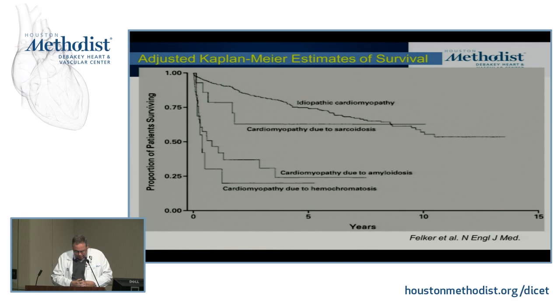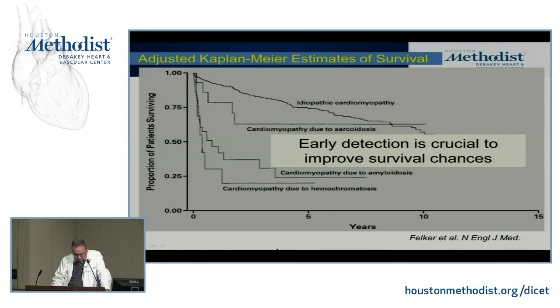So the take-home message here is, anybody that we see in the clinic that has symptoms, that the echo shows some features, some abnormalities, you're not very sure. Heart is not huge, baggy, it's more normal. You may have a lot of diastolic dysfunction. These are situations where we have to start putting things like amyloid, which are the ones that we see more commonly, up in our radar screen, because otherwise we can miss them, as it happened to that old lady that I saw in the ICU many years ago. So this is very important.